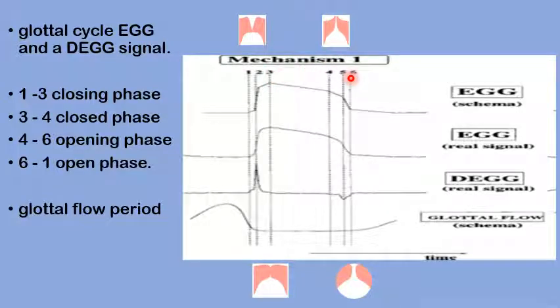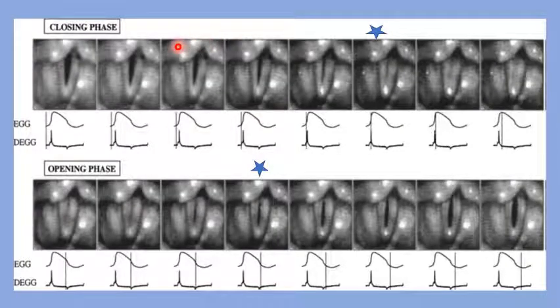Here we would see synchronized information obtained from photoglottograms showing the glottis from above, the glottal area waveform obtained from an electroglottogram, and the time derivative of the electroglottogram showing the acceleration or the deceleration of the speed of the movement of the vocal folds while closing and opening of the glottis.